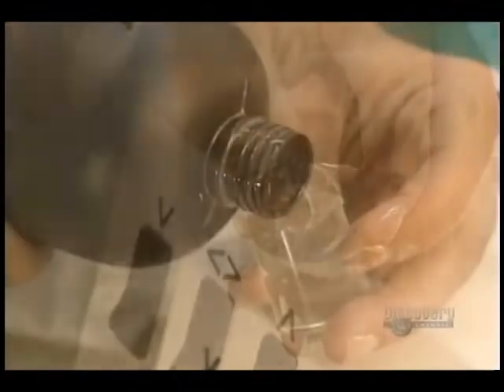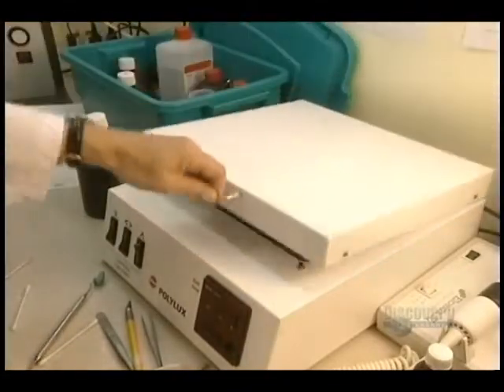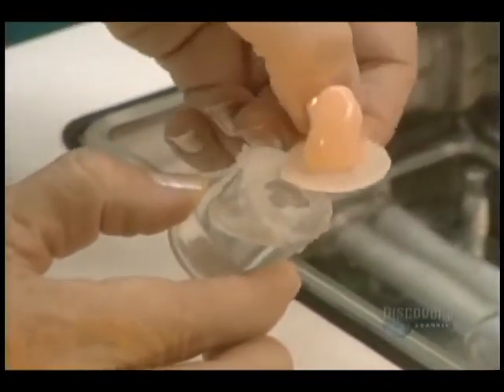It's now the molding stage for the hearing aid. Acrylic is poured into the mold before placing it into this ultraviolet oven. Without emitting any heat, this oven hardens the acrylic. Here is the raw prosthesis without its electronic components.